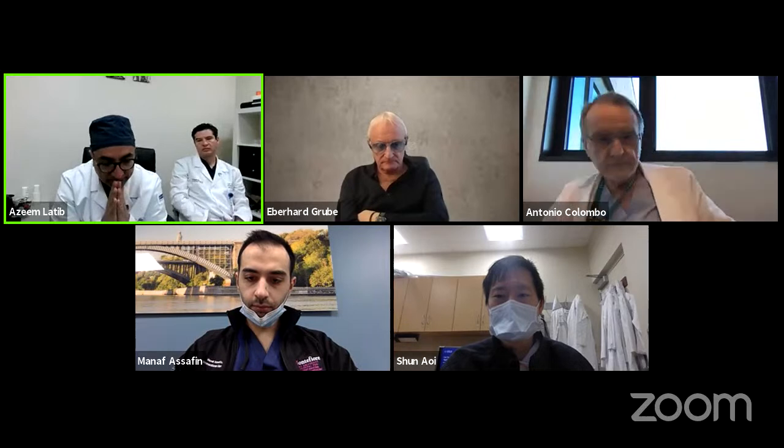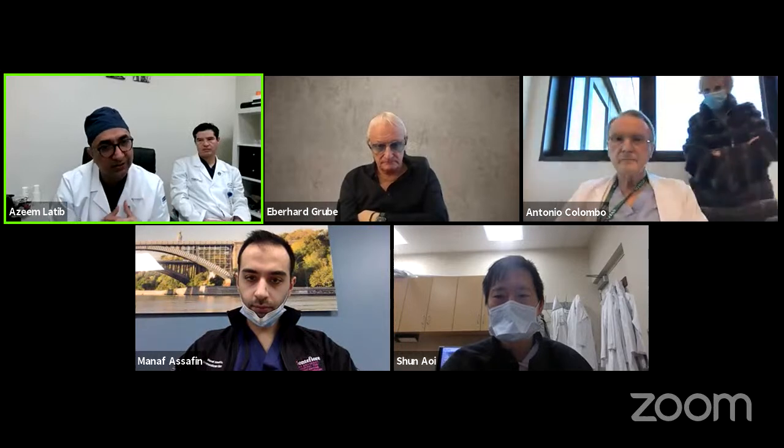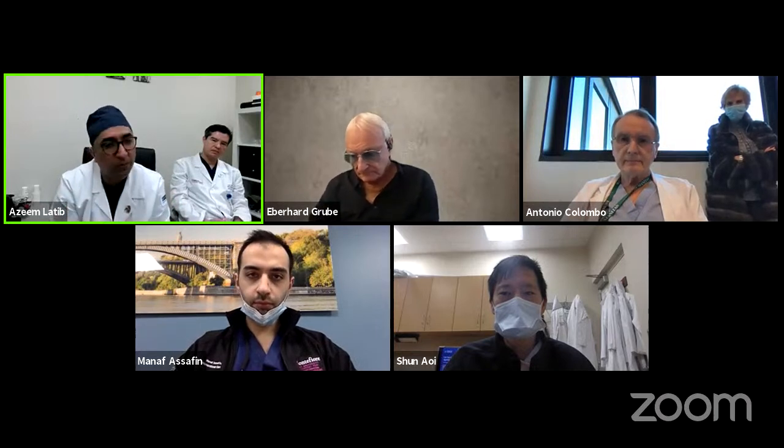Yeah, it's amazing how few SVG interventions we do anymore, because I think most of us now will try and open the native vessel as well if we can. And one other comment that I often try and explain to the fellows, but I'd love for you to explain, is the fact that when you're trying to advance a balloon or a stent and you feel resistance, not all resistance is due to the fact that the lesion needs to be more aggressively prepared. Some of it is friction that can be overcome in other ways. So by changing the position of the guiding catheter, by making the patient breathe, by putting in a wiggle wire, can you maybe just comment on that too?